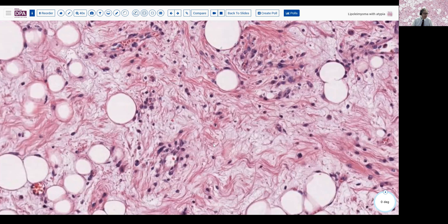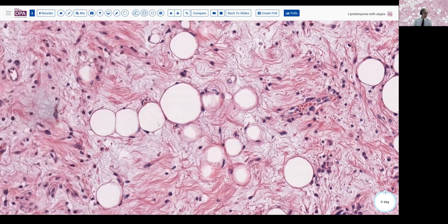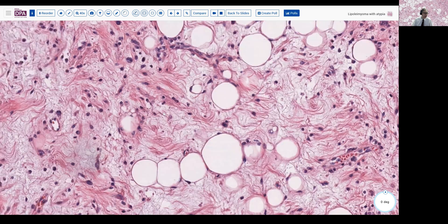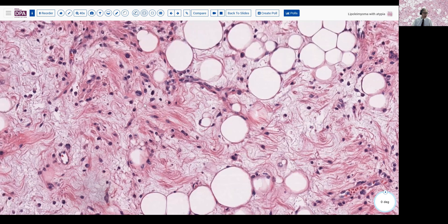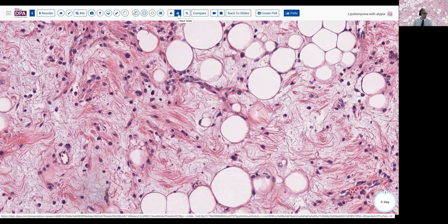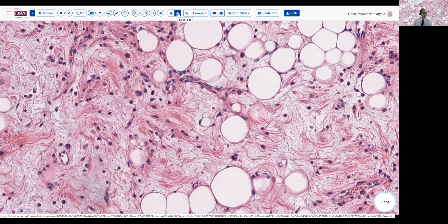And again, a degree of atypia. However, despite very careful search, I could not identify any mitotic figures. The KI-67 stain was performed and showed a rather difficult to evaluate number, given the fairly low cellularity here, but a fairly low percentage labeling with the KI-67. So, what are we going to do with this tumor with smooth muscle differentiation, fat present, and atypia?